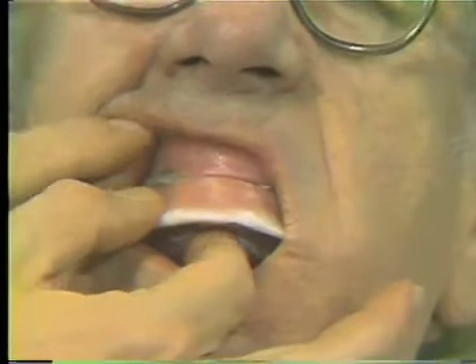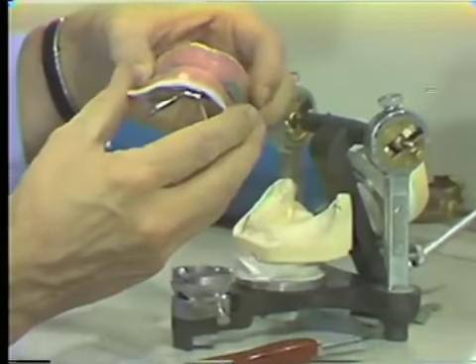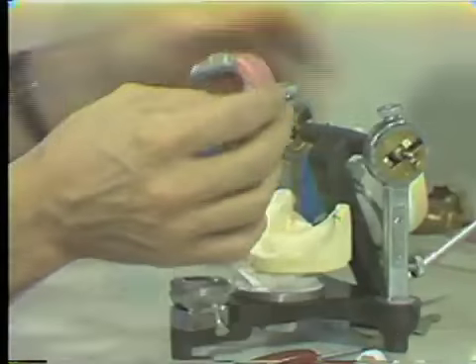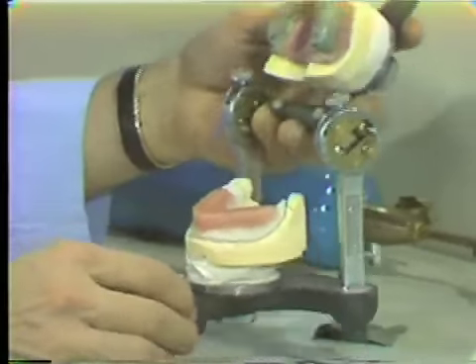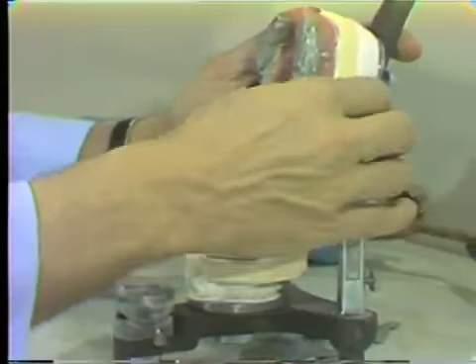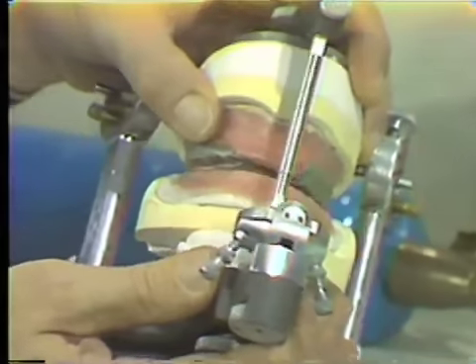And again, we go back to the articulator and adjust the condylar mechanism. Now we can separate. Place the maxillary, well seated, mandibular, completely seated, and now with our mechanism wide open and these loose so that they can go in any direction, we will now attempt to seat the two wax rims together.